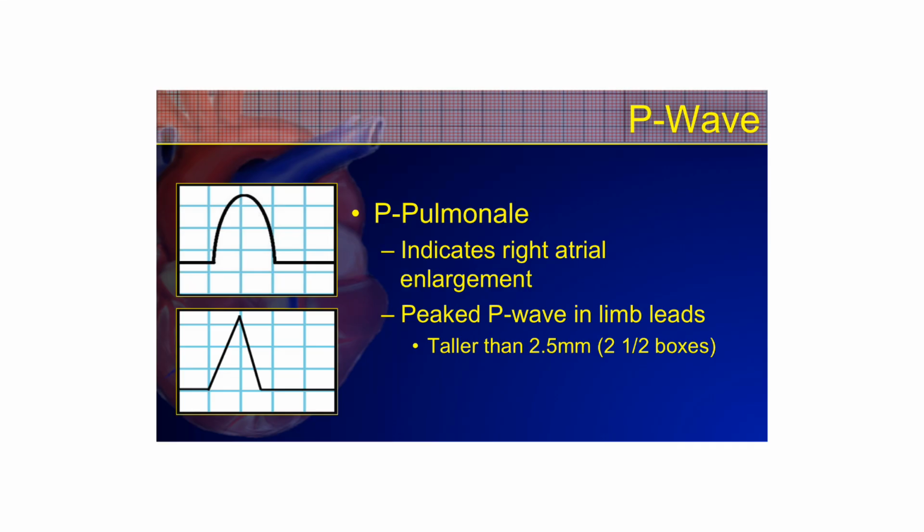And you might be wondering, how does this help us at all? What does this tell us? Well, I'll just give you one example. Who gets cardiomegaly? Who gets enlarged chambers? Your CHF patients, right? It's very pathognomonic for them to get cardiomegaly, LVH, RVH, and we know COPDers can develop cor pulmonale and get right ventricular hypertrophy. And guess what? If those ventricles get enlarged, the atria also get enlarged. The whole heart becomes enlarged eventually, and that is where heart failure comes from. That is cardiomegaly. So it is important, and it does help you.